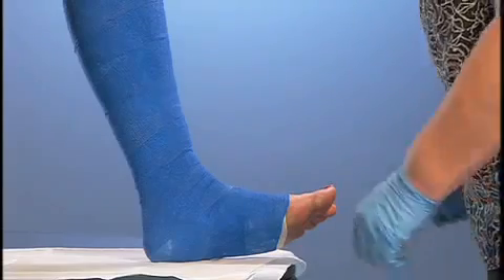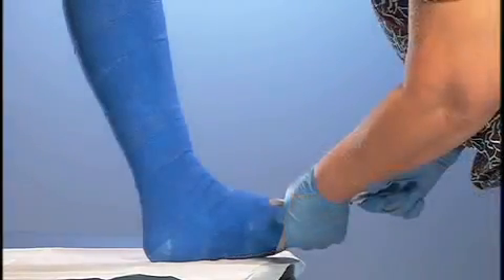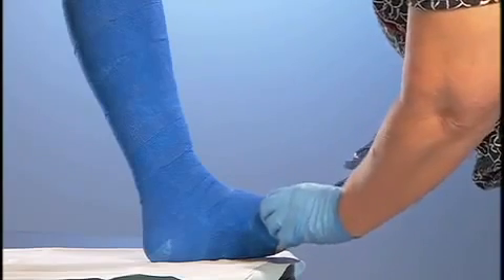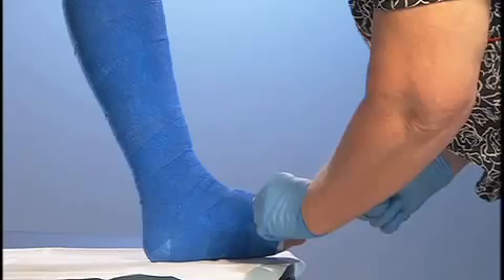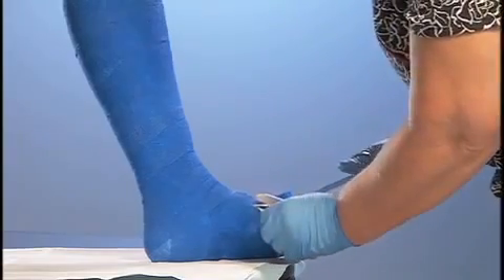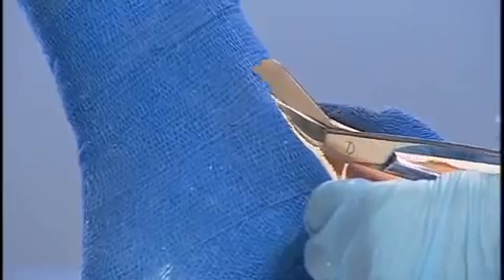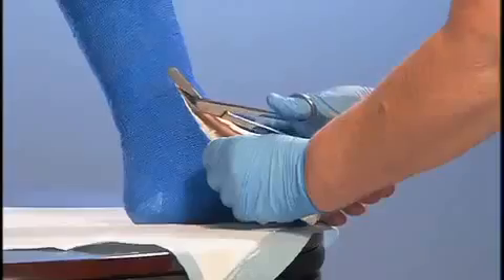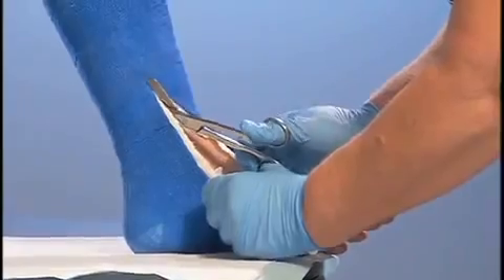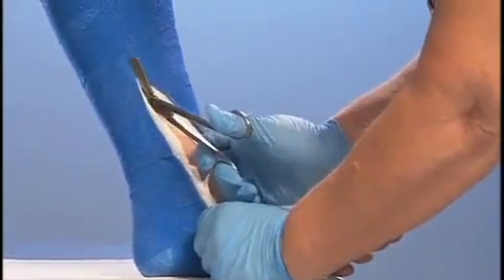To remove the bandage, use scissors or unwrap it. Begin at the bottom of the boot and cut upward to the ankle. Cut on the side opposite the ulcer, and use caution to keep the scissors away from the anterior tibial area to prevent trauma. Wear time may range from three to seven days, or when the bandage begins to loosen, slip, or become saturated.